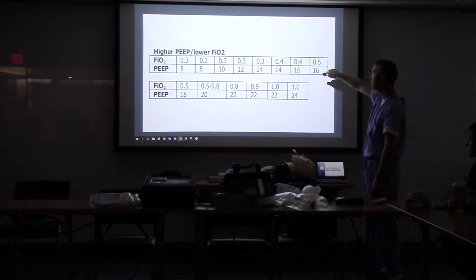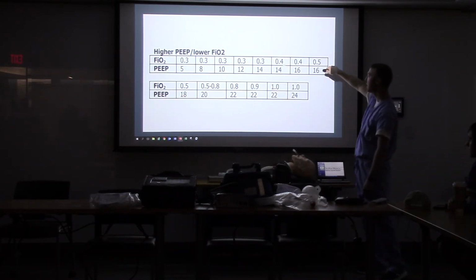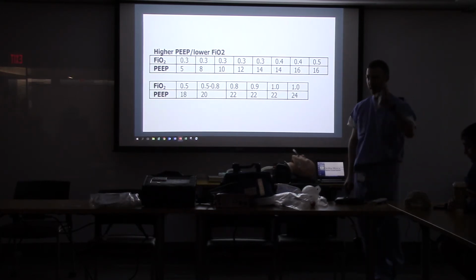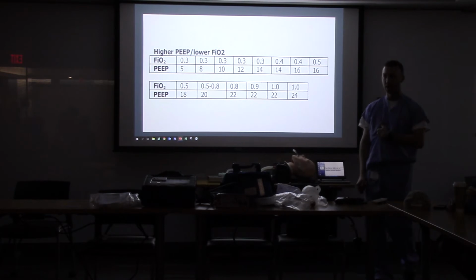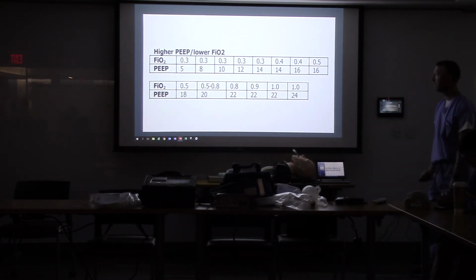And then as you go up, okay, finally I've gotten to 14 of PEEP, let's give them some more oxygen. That limits the chance of hyperoxia, which can damage the brain, the heart, the lungs. You can overdose on oxygen, which is a problem we usually can't reverse once it has occurred.